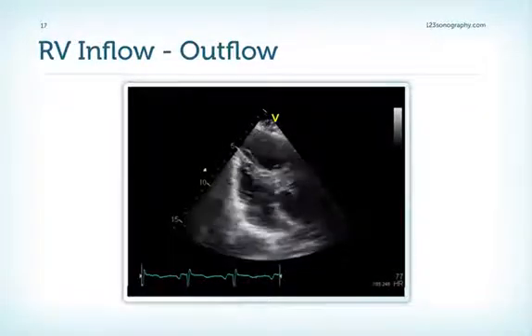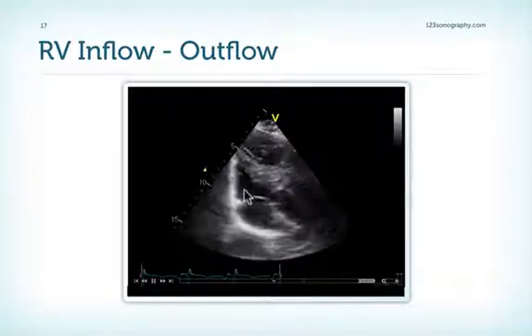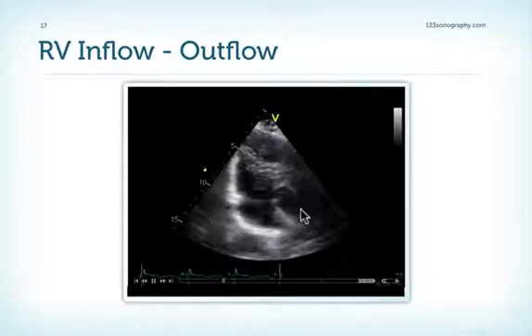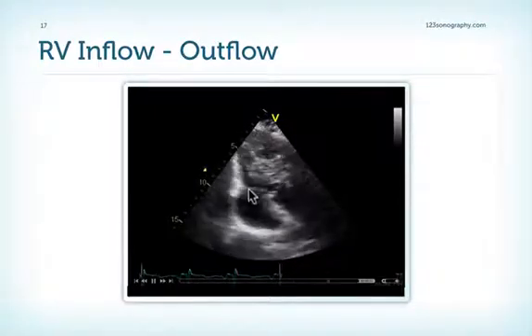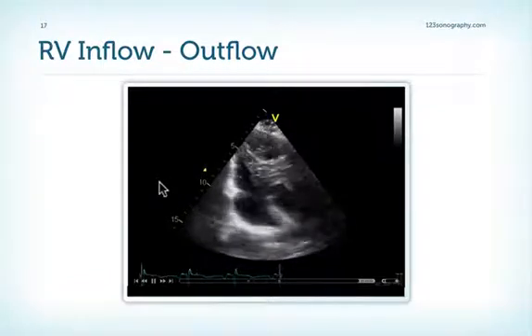Finally, in the RV inflow-outflow view, this is the right ventricle and the right atrium, with blood flowing into the right ventricle and out to the pulmonic valve. This leaflet here is most likely the anterior leaflet, while this leaflet here is the posterior leaflet.